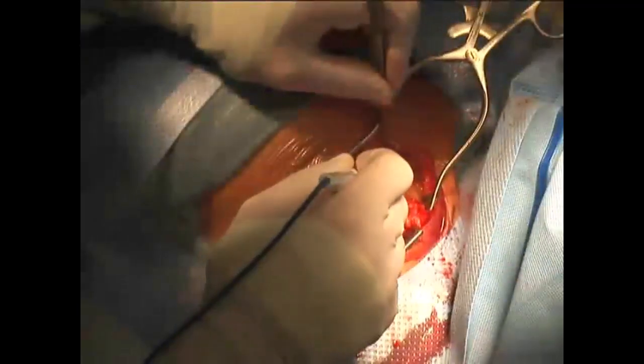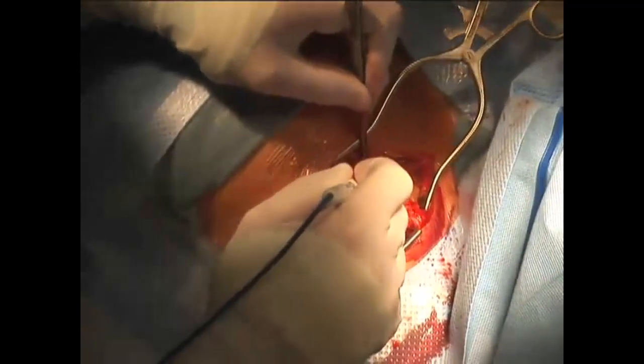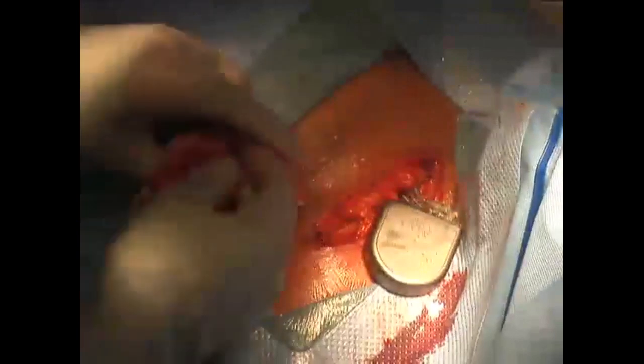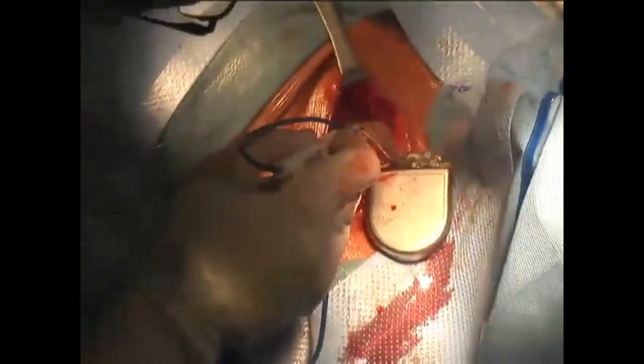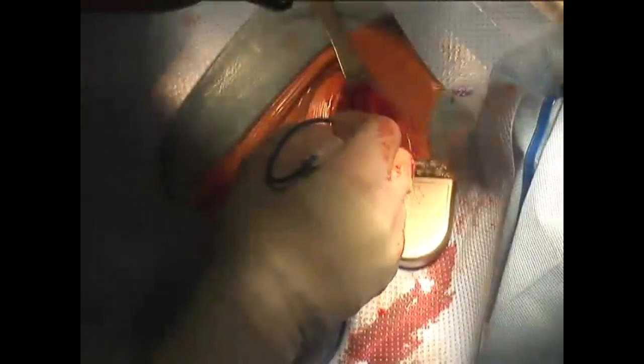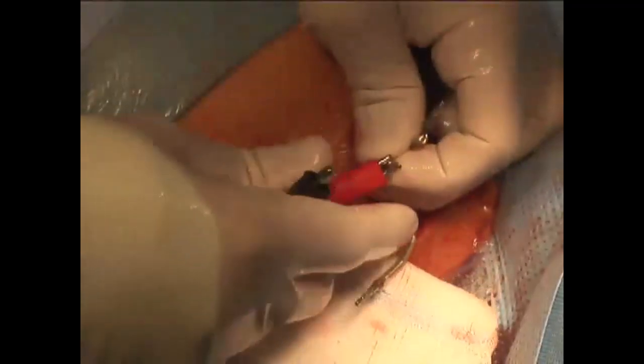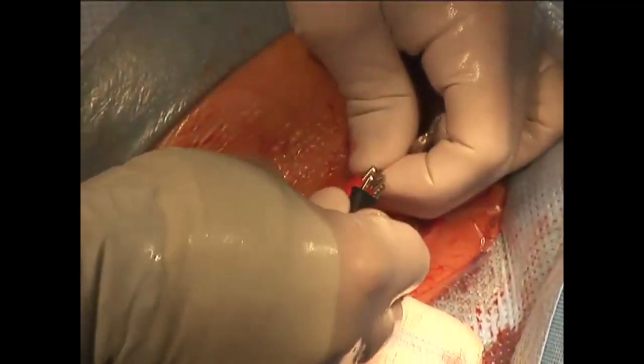The old ICD generator is found. A finger is used to dissect the tissue from the generator, and the ICD is removed from the pocket. If extra slack is needed to remove the generator, care is taken to minimize use of electrocautery on the leads to reduce the chances of an insulation breach. The leads are disconnected from the old generator using a wrench. Alligator clips are attached to the leads — the red clip goes on the ring, and the black clip on the tip.